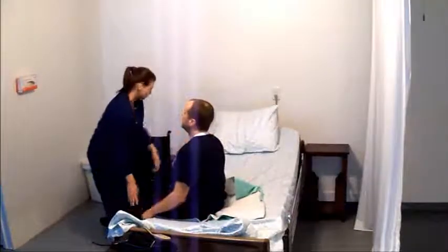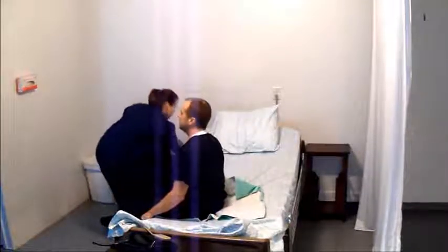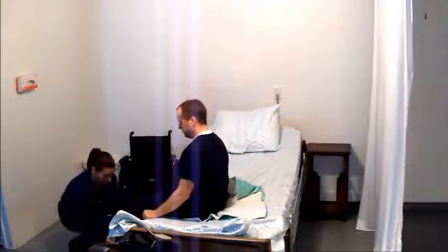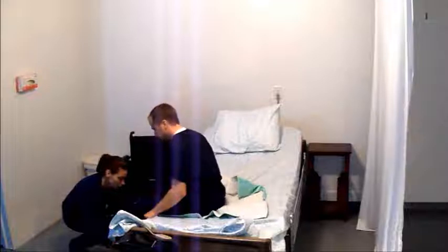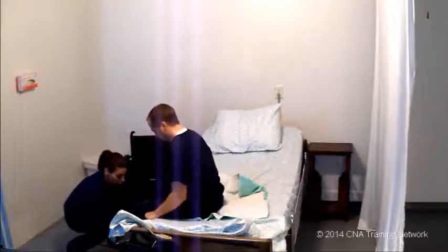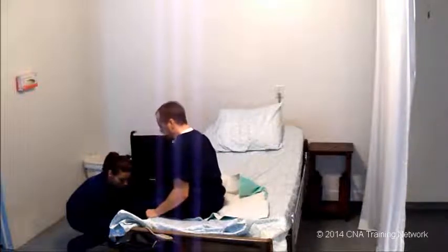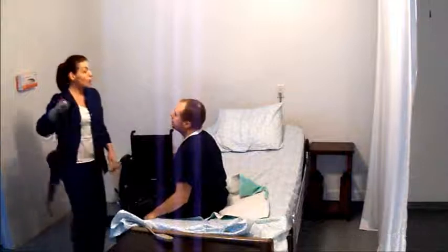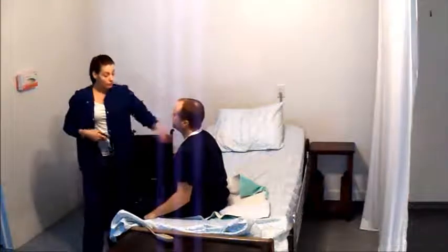Provide a cue or signal to the resident before assisting to stand. Stand in front of the resident, reaching under the resident's arms to hold the transfer gait belt at the sides or around the back throughout the transfer. Brace one or both of the resident's legs during the transfer while assisting to stand, turn, and sit.